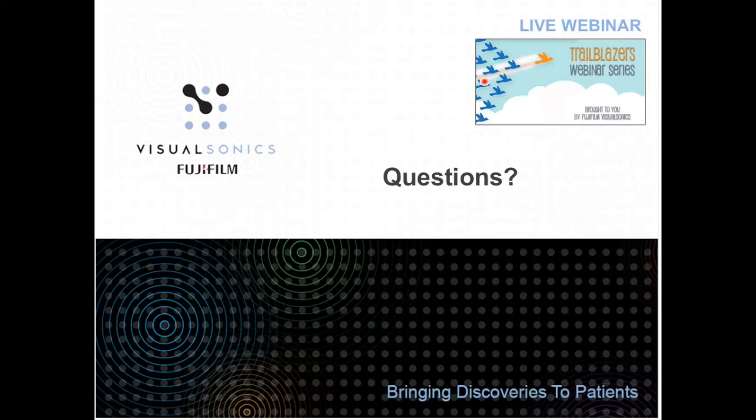There was one particular example where we were doing image-guided injections of a photoacoustic contrast agent, a dye, indocyanine green, that ICG dye that was mentioned in the bacterial imaging portion. We injected ICG, image-guided, into the synovium of the knee and watched the drainage through the lymphatics, but also watched the vascularity of the cartilage in the knee, how vascular it is, and looked at the oxygen saturation as well. So we've had a little bit of experience doing that. It depends on what you mean by in detail, but we have done some of this work.